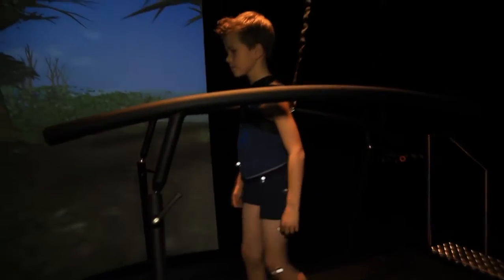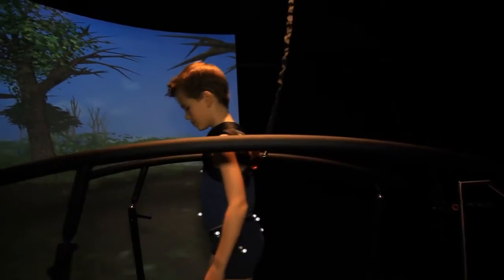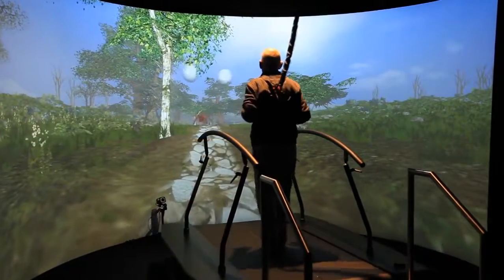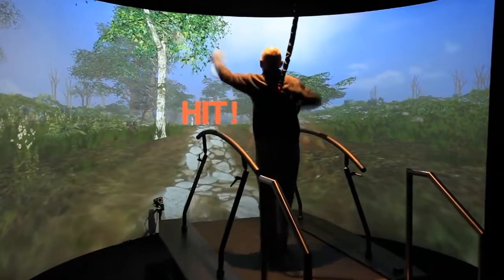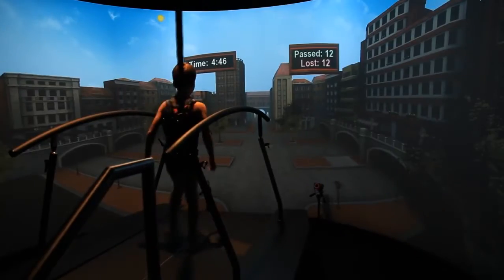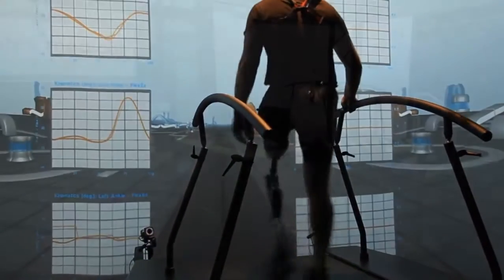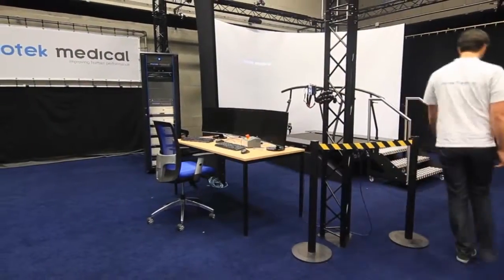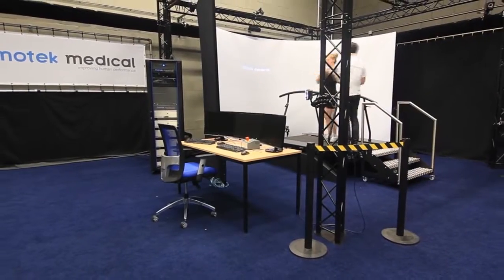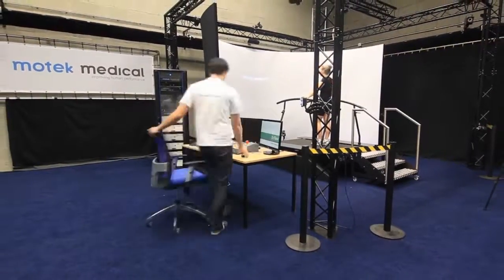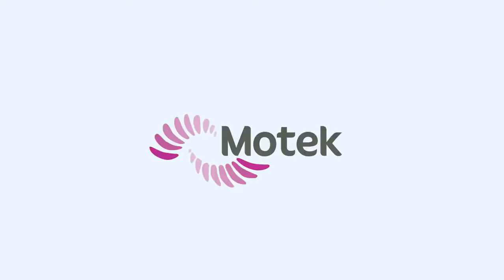Motek Medical is collaborating with many universities and clinics to develop new and improve existing applications, so your GRAIL system will receive regular updates with new functionality. Customer-specific application requests are always possible. GRAIL is Motek Medical's total package solution specifically developed for clinical use in both gait analysis and gait training. Welcome to the gait lab of the future.